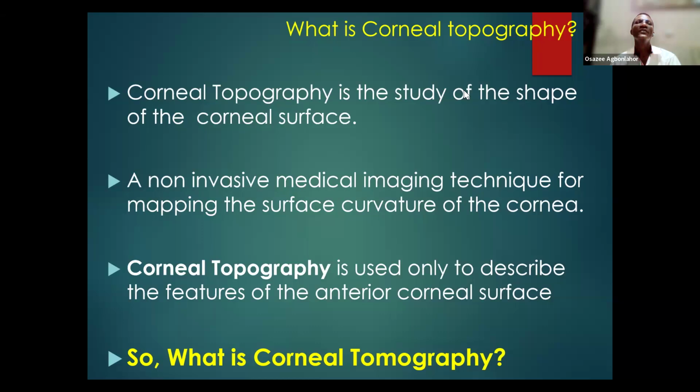And it's a non-invasive technique. You don't need to tear the eye open to assess that. It's very safe and easy to carry out. It's used to describe the anterior surface of the cornea. That's corneal topography. Then corneal tomography goes a bit deeper than corneal topography.